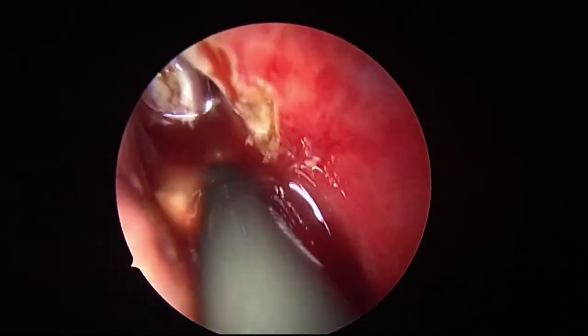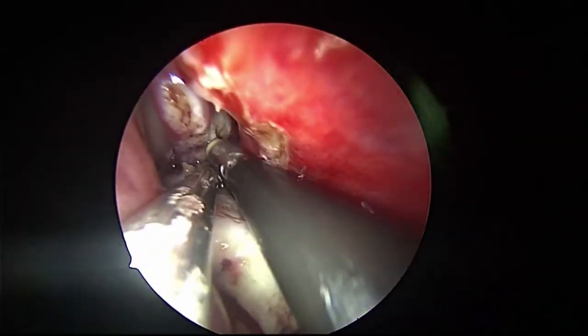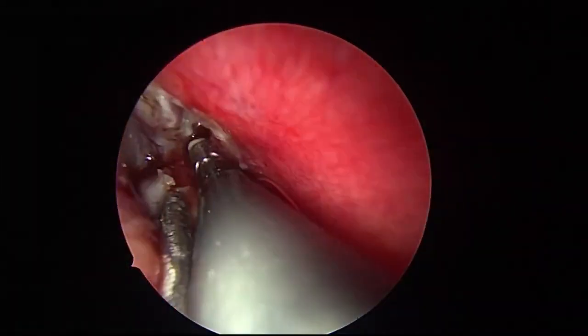Suction is needed, the suction is not powerful. Turbinate suction, the coagulator suction is poor. Take the powerful suction.